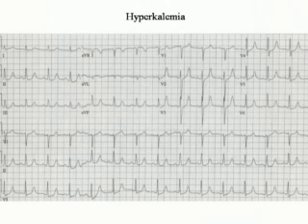Lastly, hyperkalemia. It's the only electrolyte we'll really discuss. With evidence of hyperkalemia, the first finding that you see is your T-wave tends to become very tall, disproportionate to the QRS, and it becomes very pointed. So you get an EKG, you see a T-wave you wouldn't ever want to sit on, hyperkalemia is your first thought. However, the T-wave doesn't stay like that. So the potassium 5.5 to 7 or so, your T-wave is going to show up like that.